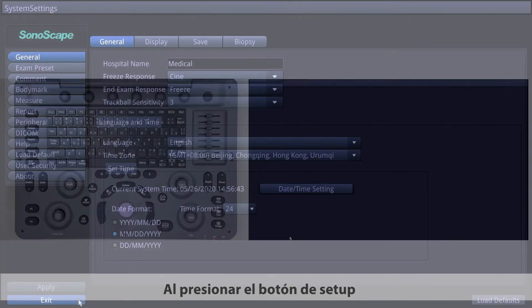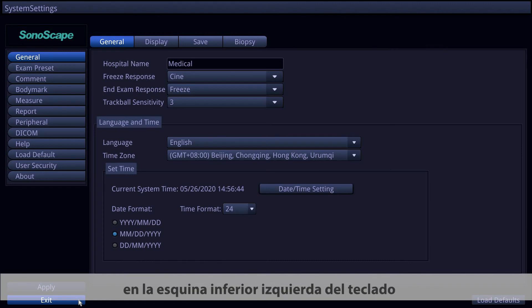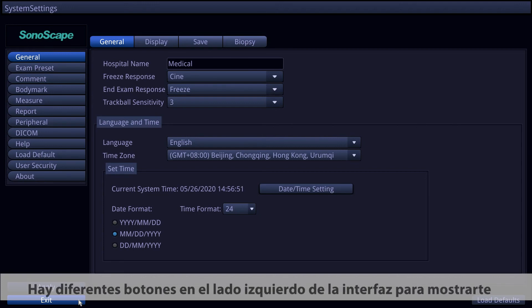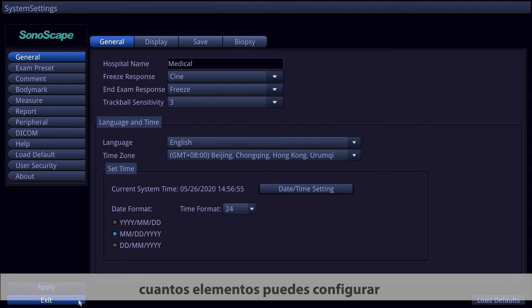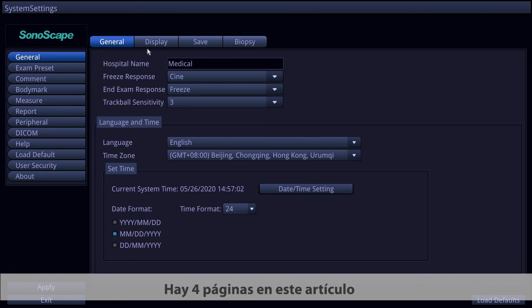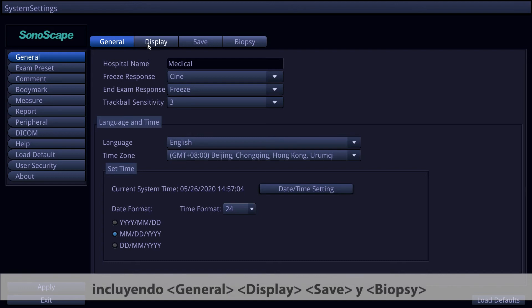By pressing the Setup button in the lower left corner of the keyboard, you will enter the settings interface. Different buttons on the left side of the interface show the available setting categories. The general settings include four pages: general, display, save, and biopsy.